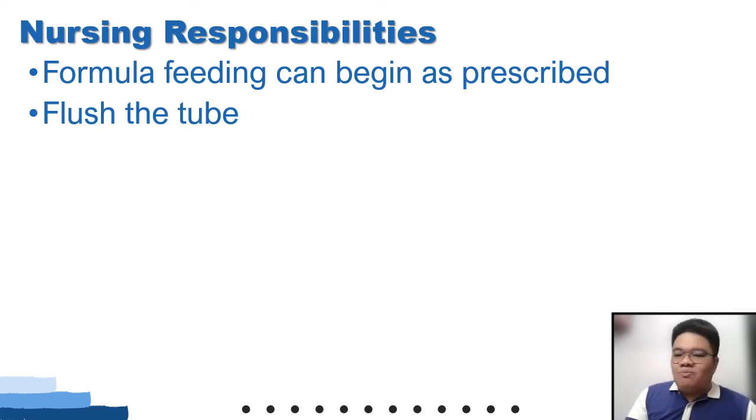Okay? Now, flush the tube. Class, again, when I say flush the tube, you just need to pour some water there on the tube before you have your feeding ongoing. Okay, before you would have your feeding ongoing.